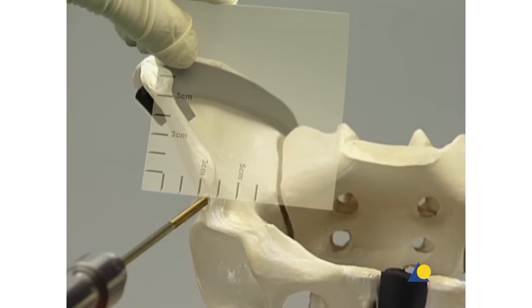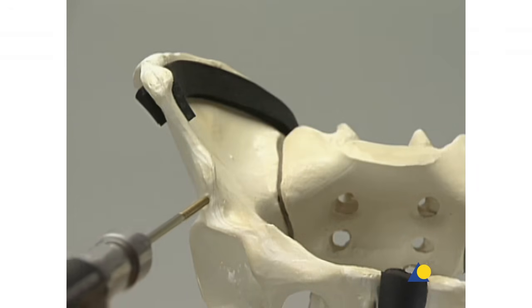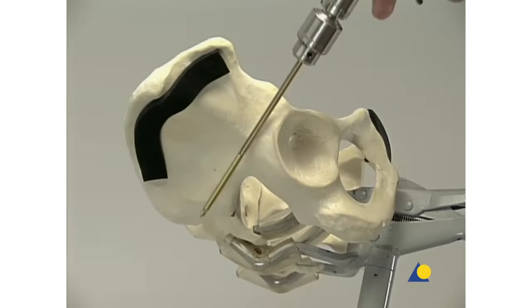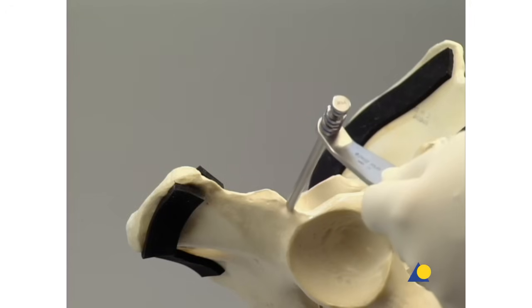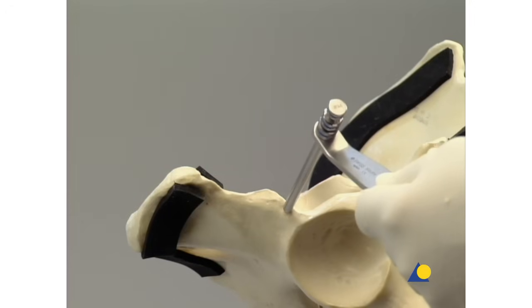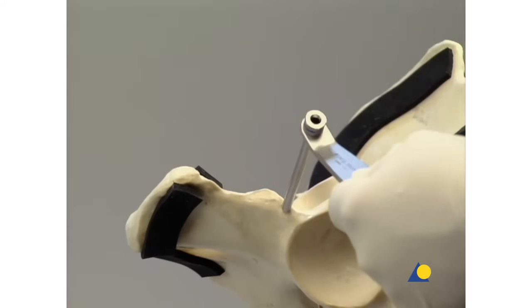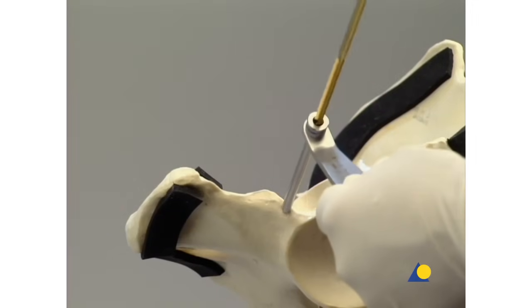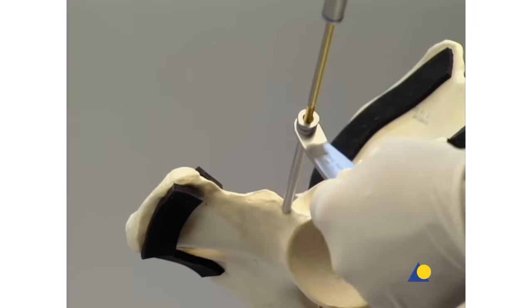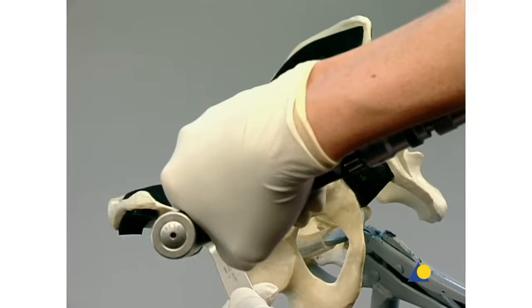This insertion point is best found with the template. The Schantz screws are angled 10-20 degrees cranially and 20-30 degrees medially. The drill sleeve assembly is inserted through the incision and placed directly on the bone surface. The trocar and drill sleeve are removed. The first Schantz screw is inserted through the outer sleeve of the drill sleeve assembly, angled 20-30 degrees medially and 10-20 degrees cranially.